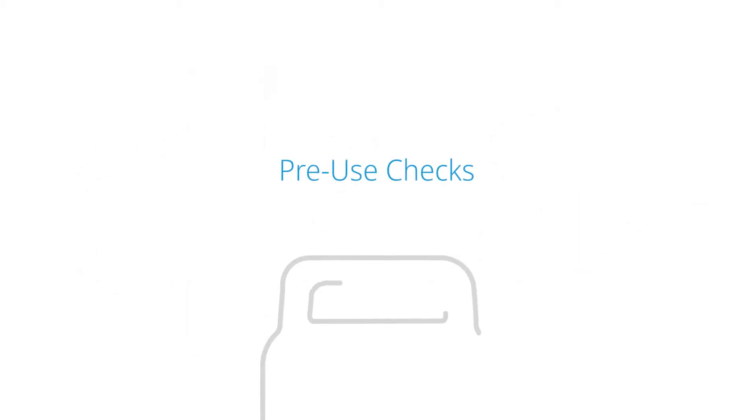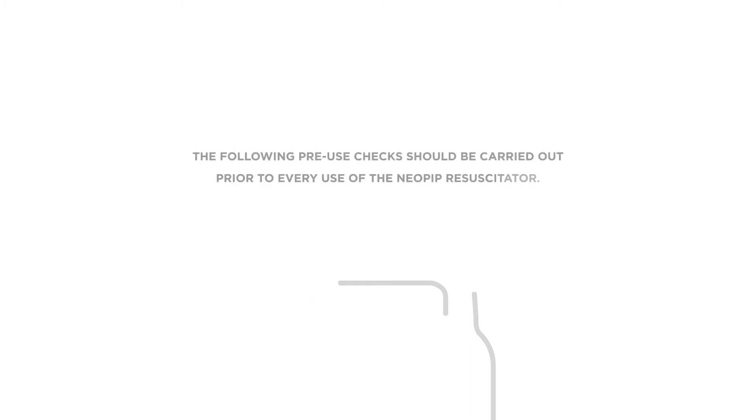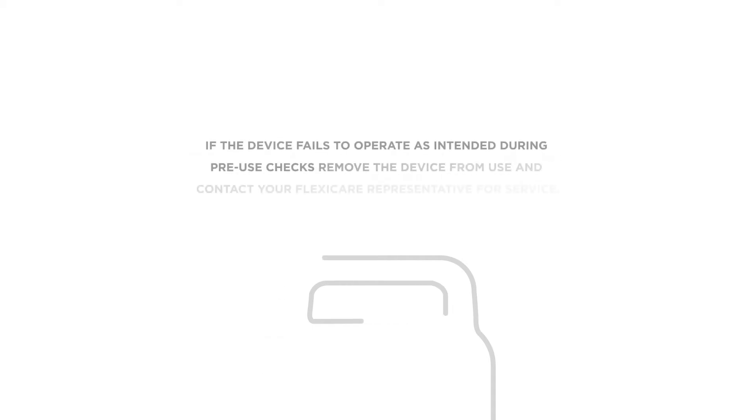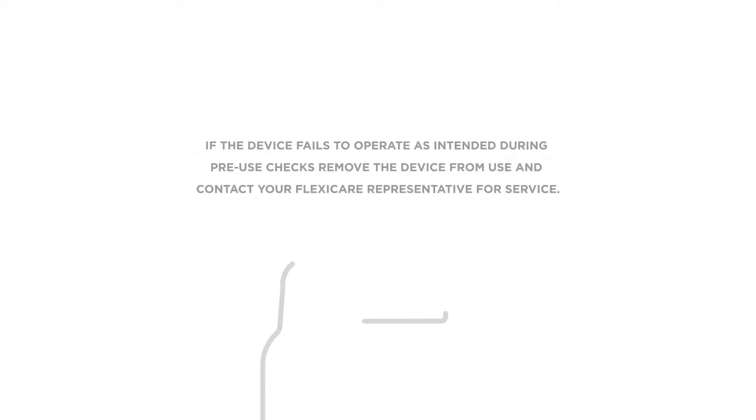Pre-use checks. The following pre-use checks should be carried out prior to every use of the Neopip Resuscitator. If the device fails to operate as intended during pre-use checks, remove the device from use and contact your FlexiCare representative for service.